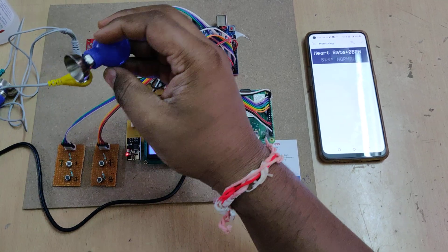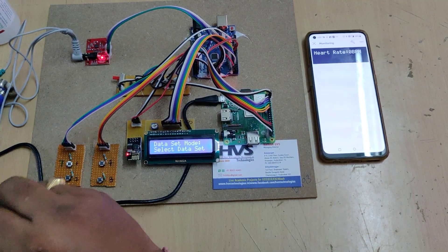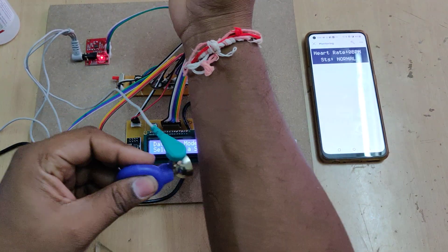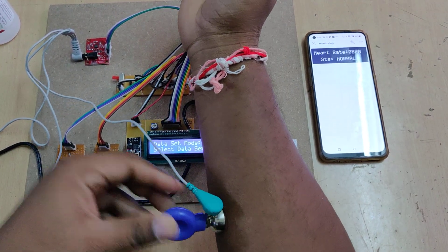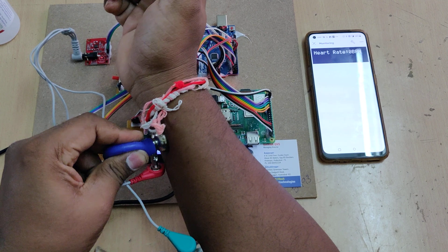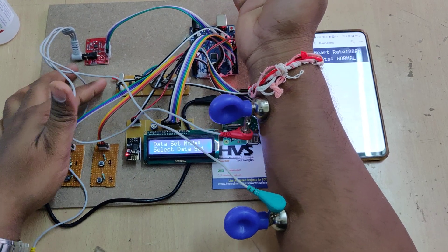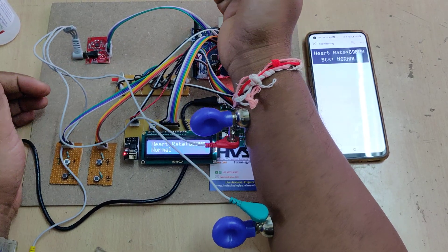When you are keeping it in auto mode, sensor mode, you should mount the electrodes properly. Previously there was a problem with the Blynk application due to mobile data being disabled. Now I am keeping it in auto mode — below is the auto mode.